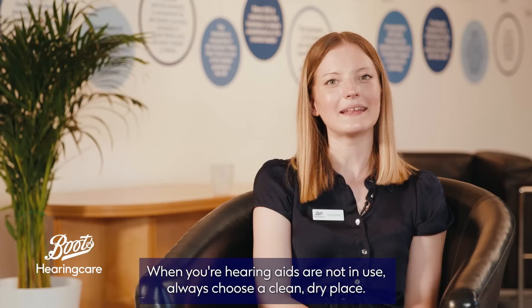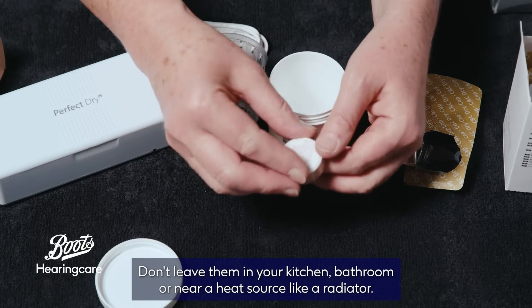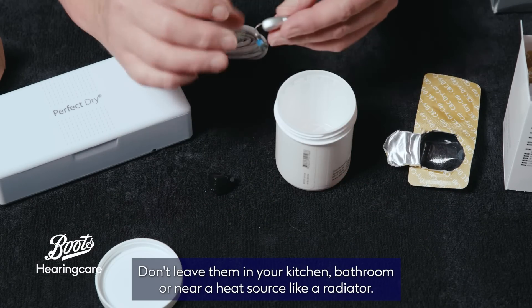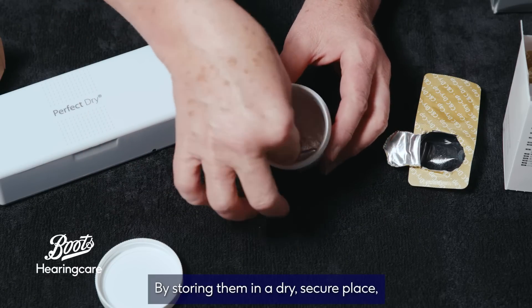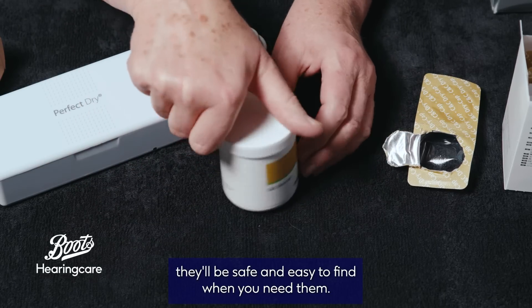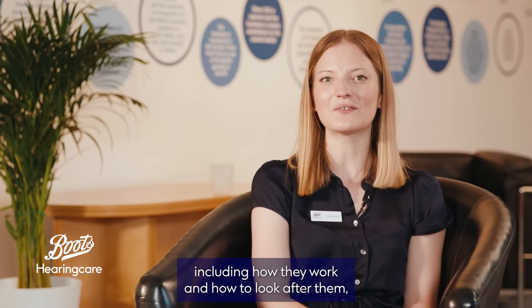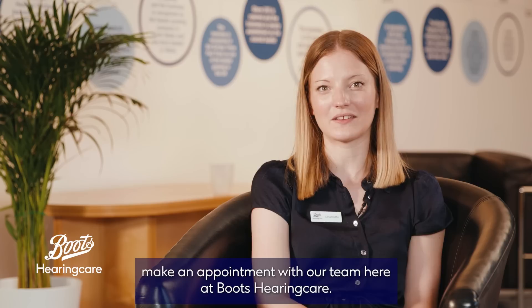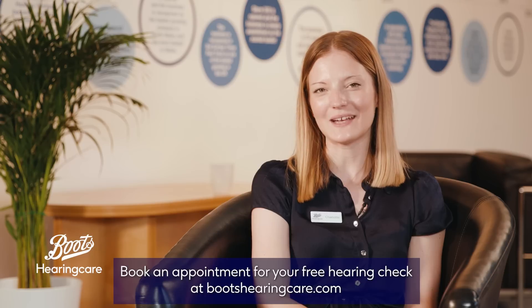When your hearing aids are not in use, always choose a clean, dry place. Don't leave them in your kitchen, bathroom, or near a heat source like a radiator. By storing them in a dry, secure place, they'll be safe and easy to find when you need them. If you want to find out more about your hearing aids, including how they work and how to look after them, make an appointment with our team at Boots Hearing Care. Book an appointment for your free hearing check at bootshearingcare.com.